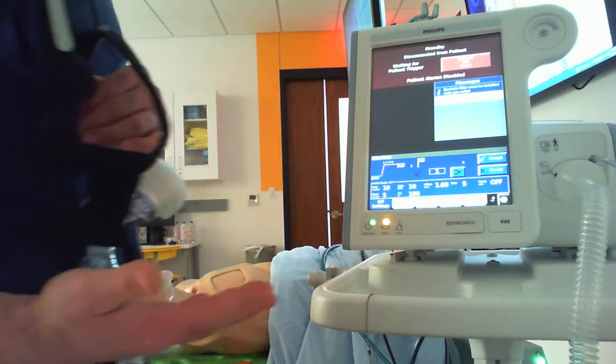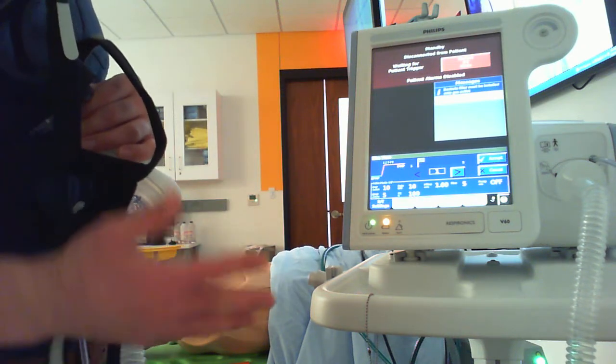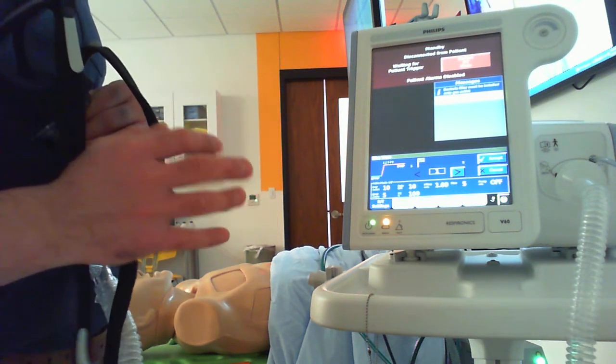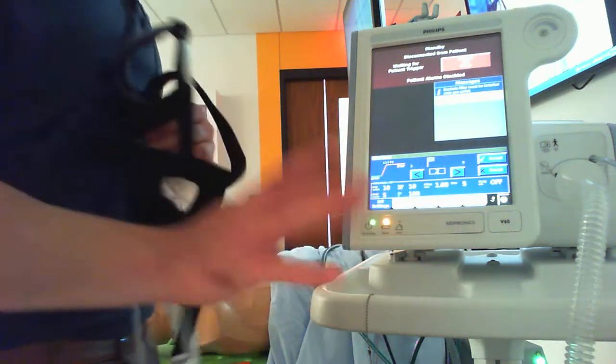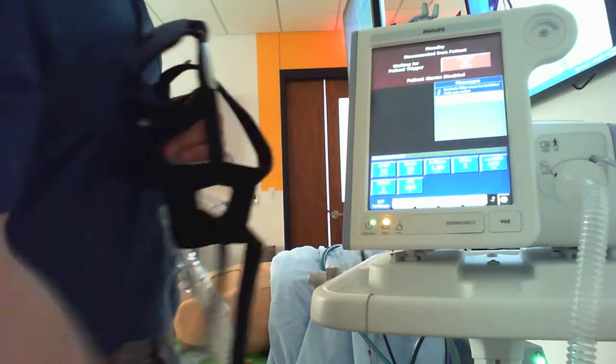Honestly, unless you're doing this for like sleep time, nocturnal hypoventilation kind of stuff, I don't find myself using that gentle rise very often. 1 or 2 is a good starting point. As you learn more about ventilator graphics, you can further refine that later on. So I'm going to go ahead and accept.